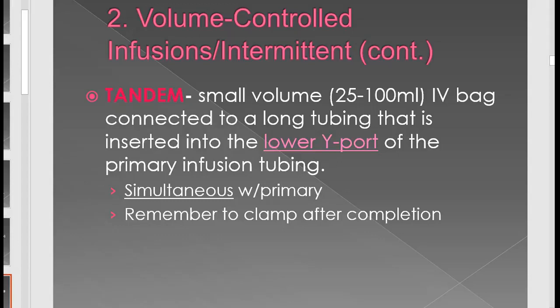Now, I don't have a video to show you this, but what I want you to think about is that if I'm going to have to connect it to the lower Y port, which is closer to the patient, I'm going to have to get a separate pump. And what this means is that the tandem and the IV primary bag will be running at the same time. When you have a piggyback that's running with or connected to a primary bag, it is not running at the same time because it's on one pump.